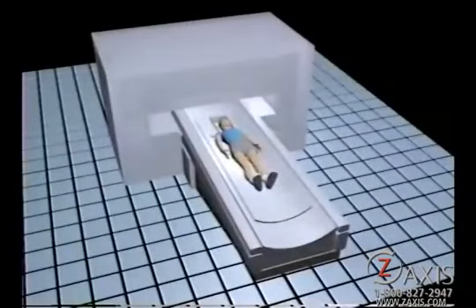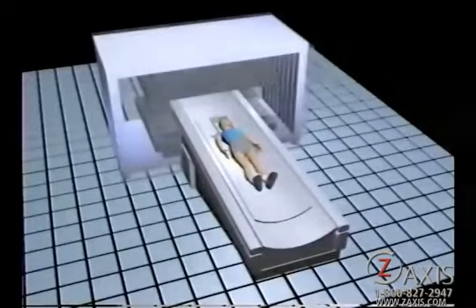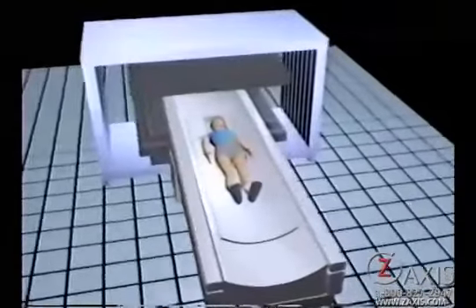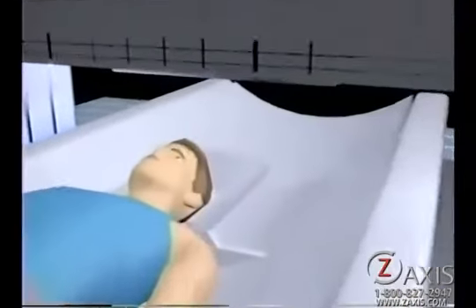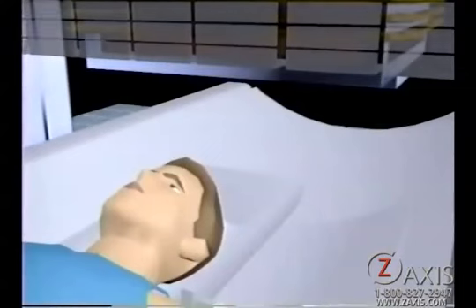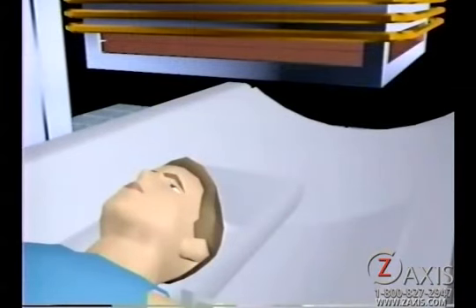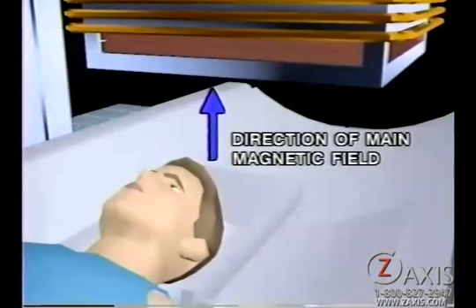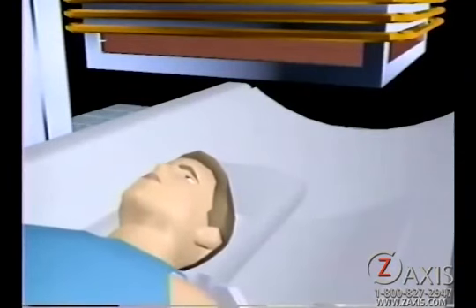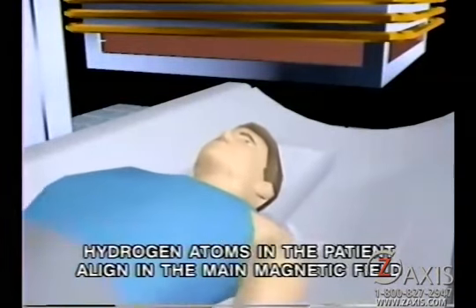Now that we have the basics, let's look at our patient inside the MRI machine. The large gray blocks above and below the patient are the permanent magnets that supply the strong external magnetic field. The bottom magnet is the south pole and the upper magnet is the north pole, creating a magnetic field in the direction of the blue arrow. As the patient slides into the machine, his protons snap into alignment with this magnetic field.